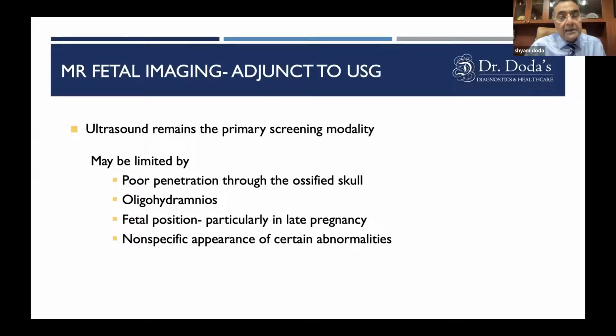When the amniotic fluid is less, again, there are problems because all the fetal parts are jam-packed. It's difficult to separate those parts. And when the fetal position, for example, in relatively late pregnancy, has the spine towards the posterior side, there are so many things.